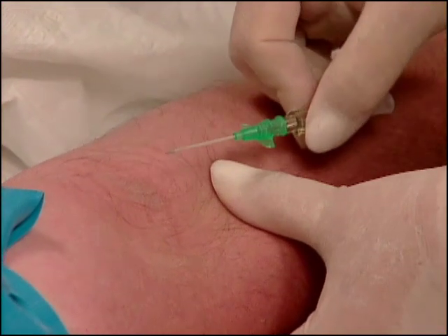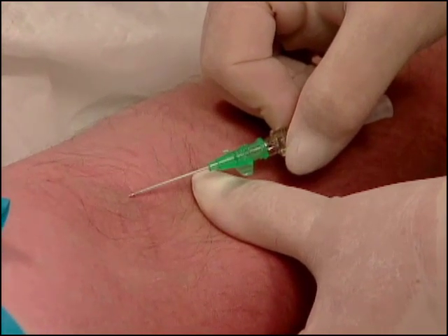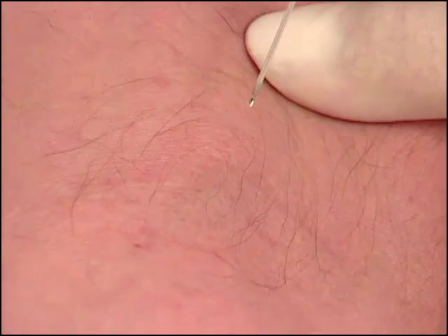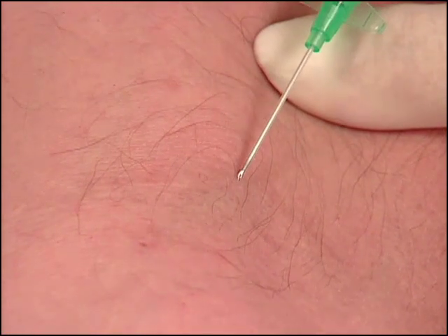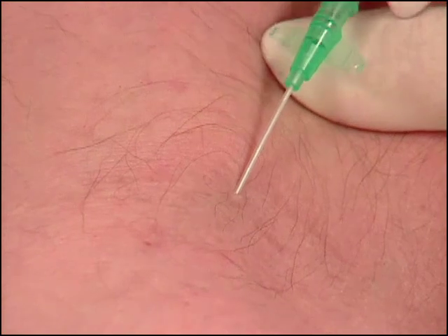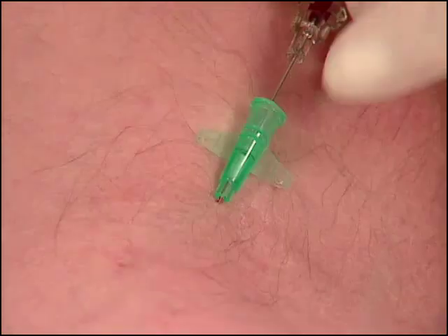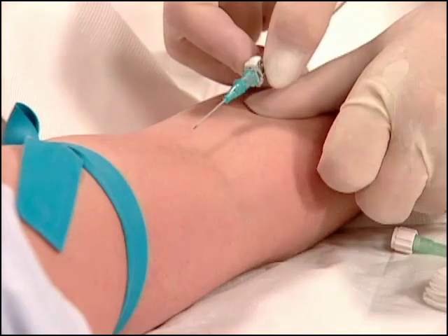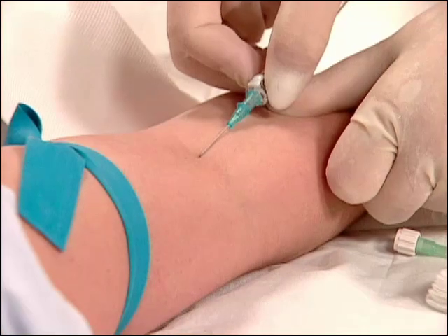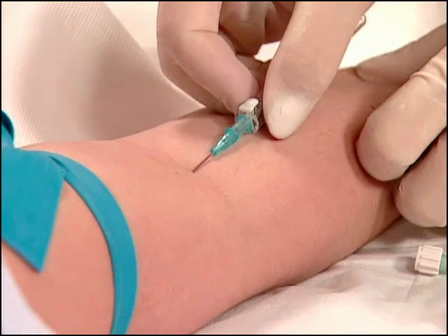Hold the catheter in your dominant hand and turn it so that the bevel is facing up. Inform the patient of the imminent stick to decrease the likelihood of the patient moving while the catheter is being inserted. Quickly insert the catheter at a 10 to 30 degree angle into the vessel. Look for a flash of blood in the chamber. Advance the catheter approximately 1/3 of a centimeter or 1/8 of an inch after the flash is seen in order to seat the catheter in the vessel.